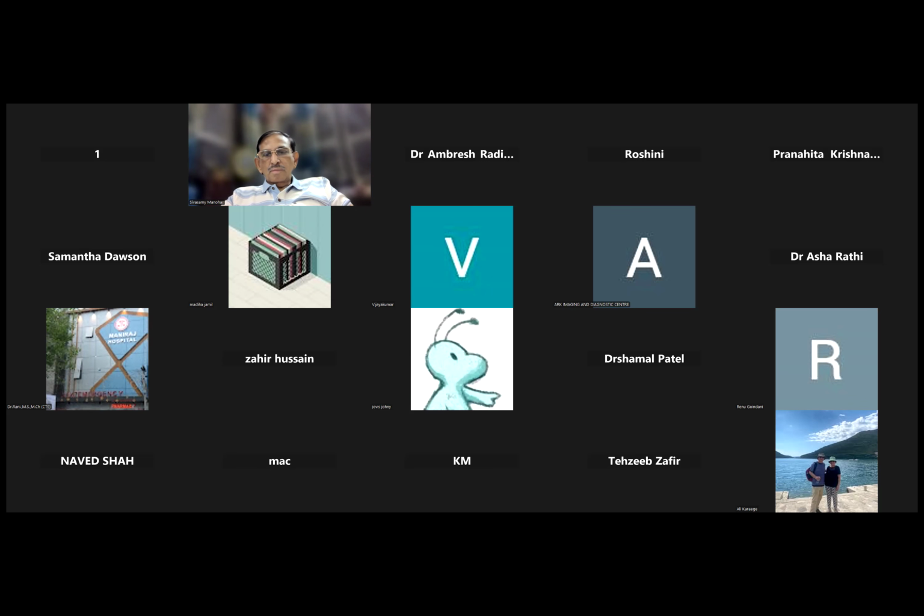Isolated is called isolated when we prove it is isolated. You rule out all the other things, technical and genetic, and only then can you call it isolated. So it can be postural. It can have always cluster, but you look at the overlapping fingers, that's quite abnormal. Roshni has shown clearly with the clinodactyly and the camptodactyly very well. When you see overlapping fingers, it's definitely abnormal. Otherwise, when the fetus is keeping its fist clenched, I don't think it is abnormal. You'll wait for the fingers to open.